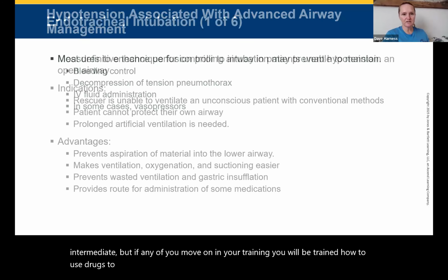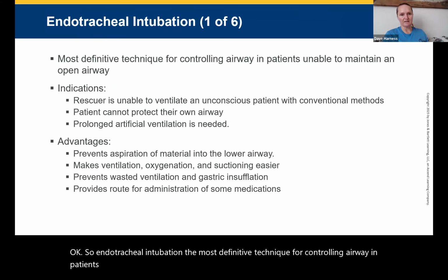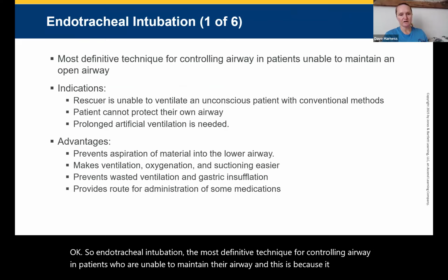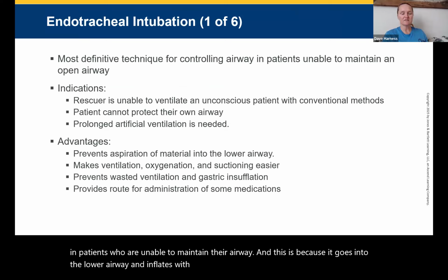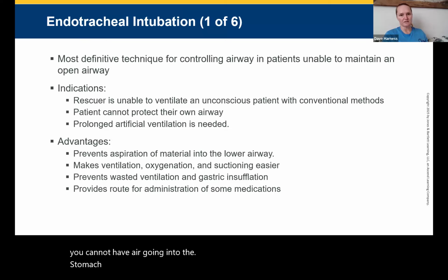Okay, so endotracheal intubation, the most definitive technique for controlling the airway in patients who are unable to maintain their airway. And this is because it goes into the lower airway and inflates with a cuff that completely seals off the airway so that you cannot have air going into the stomach or secretions going into the lungs.